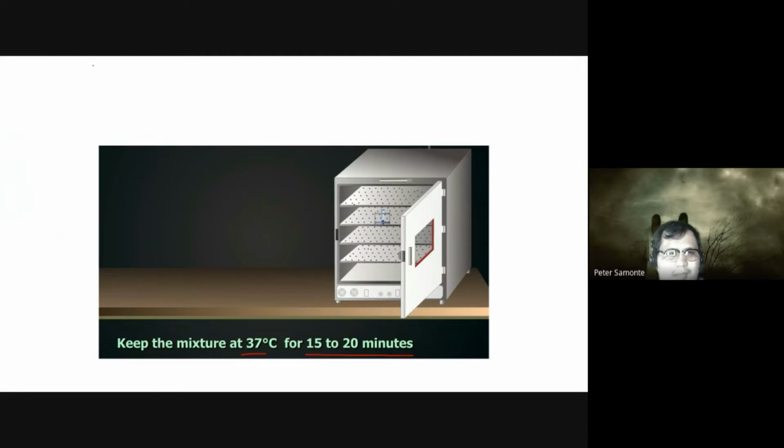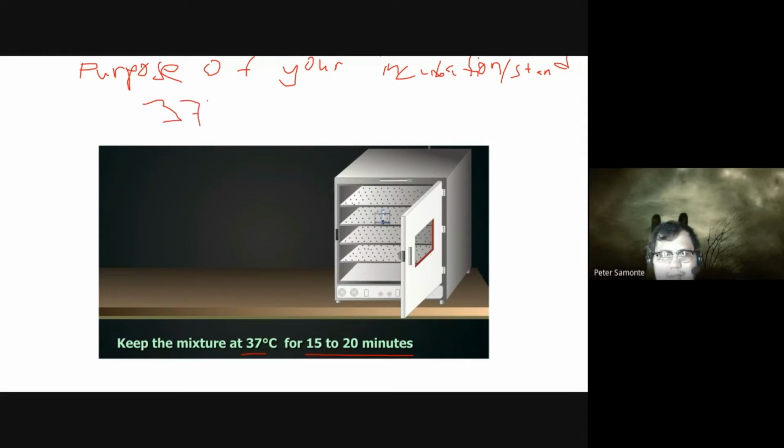Class, can anyone tell me the purpose? What is the purpose of your incubation or standing? Bakit kailangan i-incubate or i-stand yan? And bakit din 37 degrees? Anong meron sa 37 degrees centigrade?